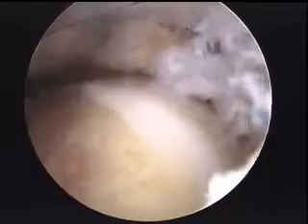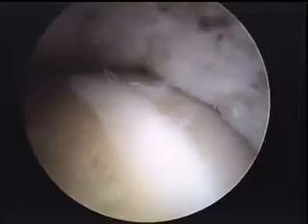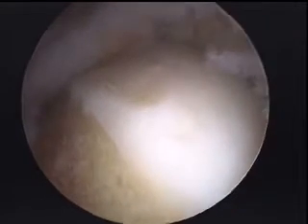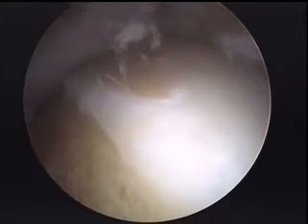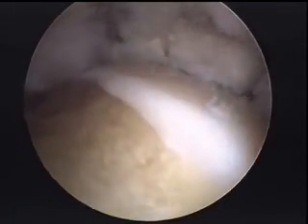So here we've finished out. We're through the anterior portal, so you can get a different view, and we're moving his hip, showing that the impingement is no longer there. Flexing him up, he's about at 70 degrees right there, right where he would start impinging preoperatively. And here we have our margin of normal femoral head cartilage going to our osteoplasty area. And again, we're going to use this portal to assess and make sure there isn't any other area that we want to continue our osteoplasty. But this looks pretty good.